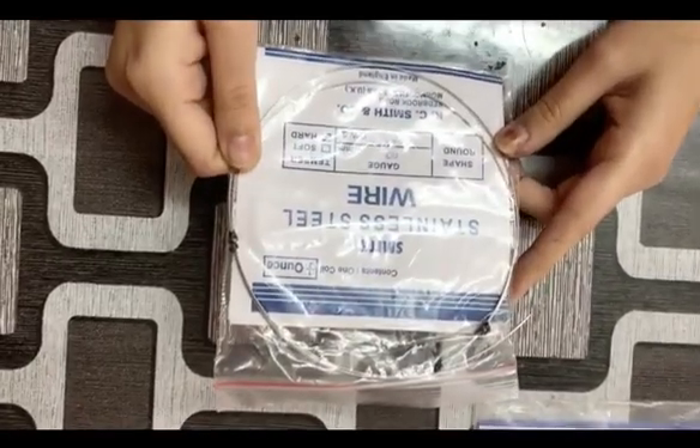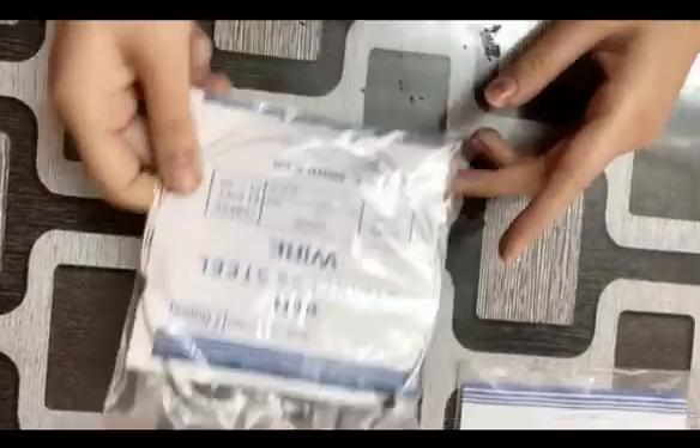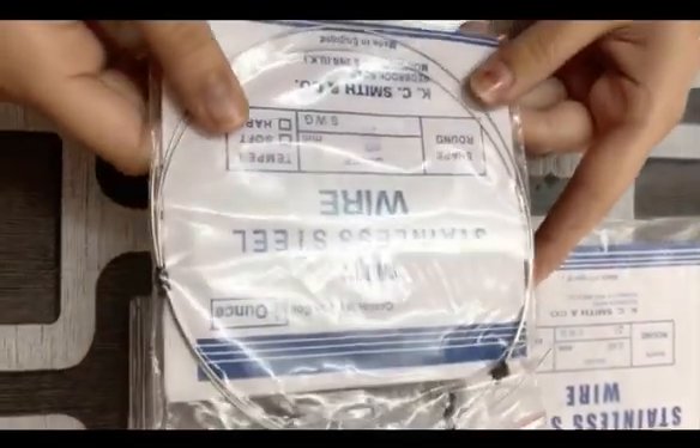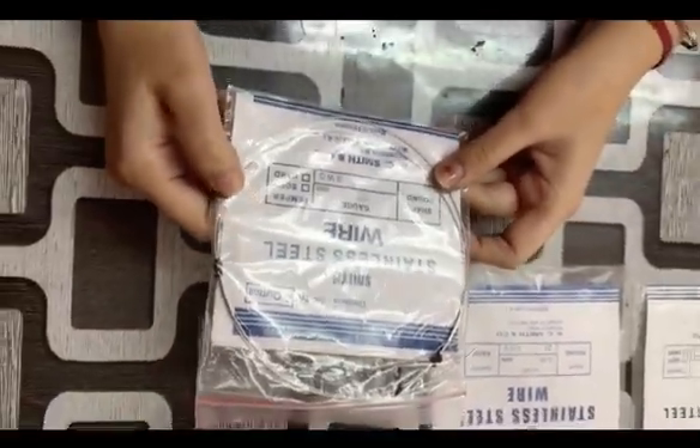It contains 18% chromium and 8% nickel. Here I'm having 21 number wire. It is also available in 19 number, 23 number, and so on. As the number increases, the diameter of the wire decreases.